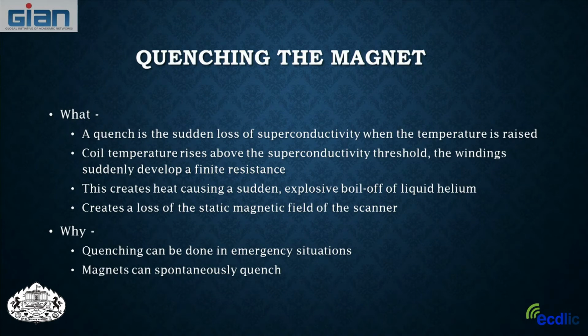So this is a problem that we don't want to have, of this magnet quenching unless it's a real issue or something's going on. We've had cases of people leaving, so a guy came from FedEx, and he actually left a package inside the magnet room. And this is a very, very big safety concern. But when they came in the morning, this package was in the bore of the magnet. And since they weren't sure what it was, they ended up quenching the magnet.